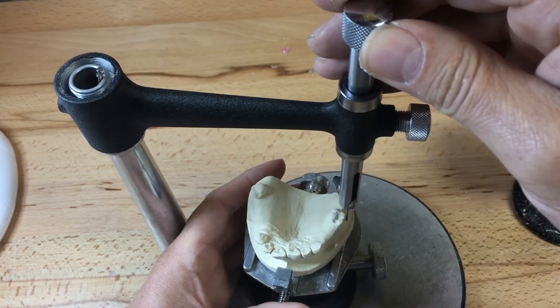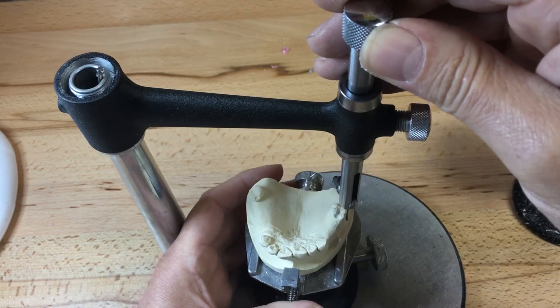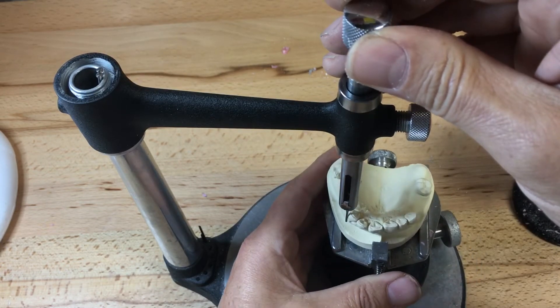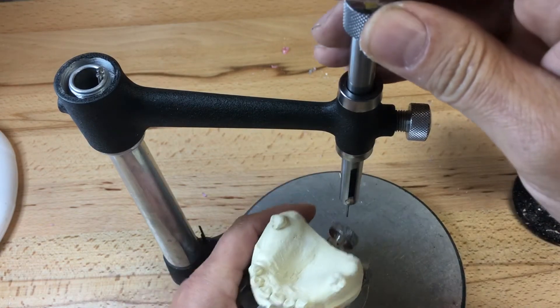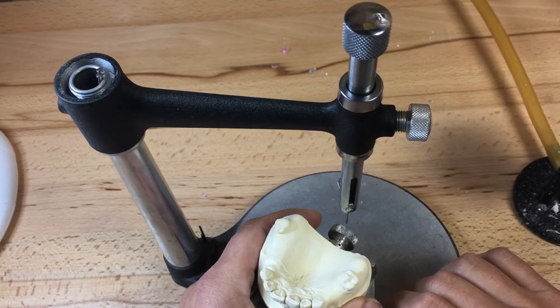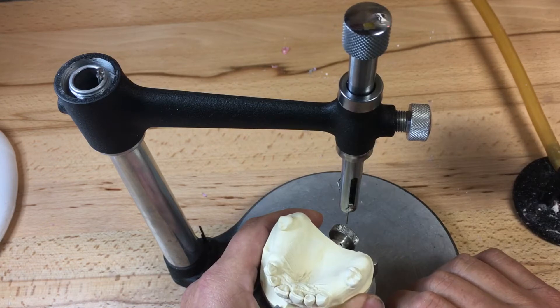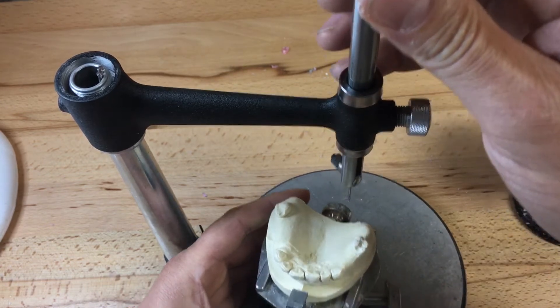I'm looking at the distal buccal undercut of the Akers of 1-6 and trying to equalize the depth of the clasp on 2-7 as well as on 1-3 and 2-3, which will be wrought wire clasps. They'll be engaging at 0.75 millimeters undercut rather than the cast clasp Akers retentive arm at 0.25 millimeters undercut. These clasps on the anterior are obviously in the aesthetic zone, so I'd like to lower them a little bit.